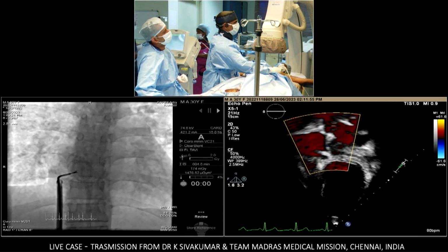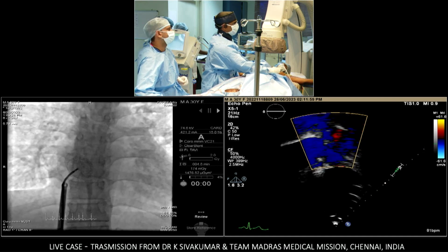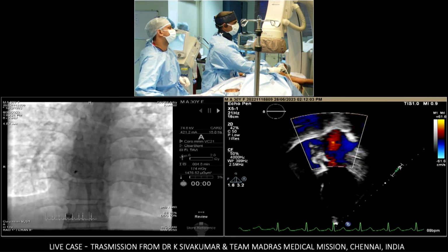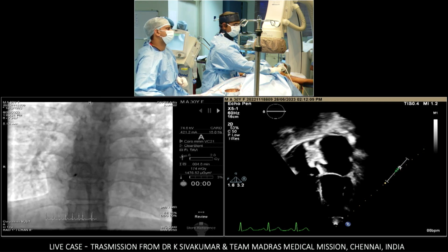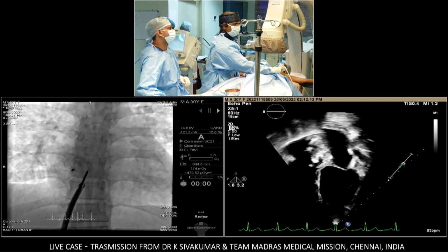That's the right lower pulmonary vein. You are able to see there? It's far away. It's in another plane. This device is more anterior. Can you see, Mai? Yeah, I can see it now, but it kind of looks bulky. I think you need more. I mean, I don't know. Shiva, I can't see the. Yeah, so that's a good view there. That would show us better.